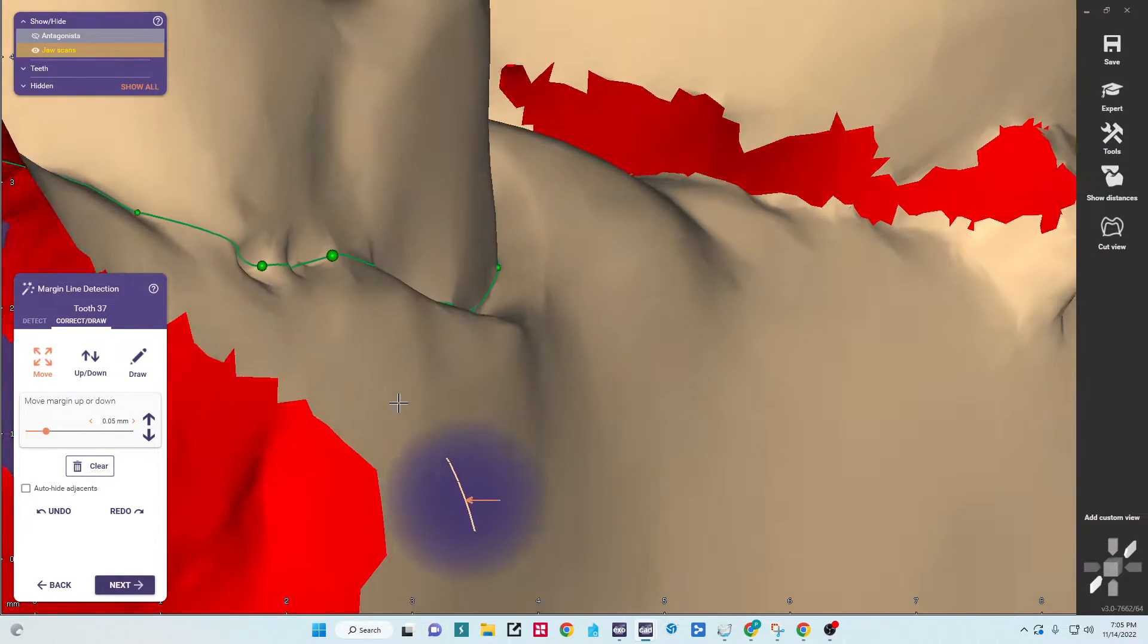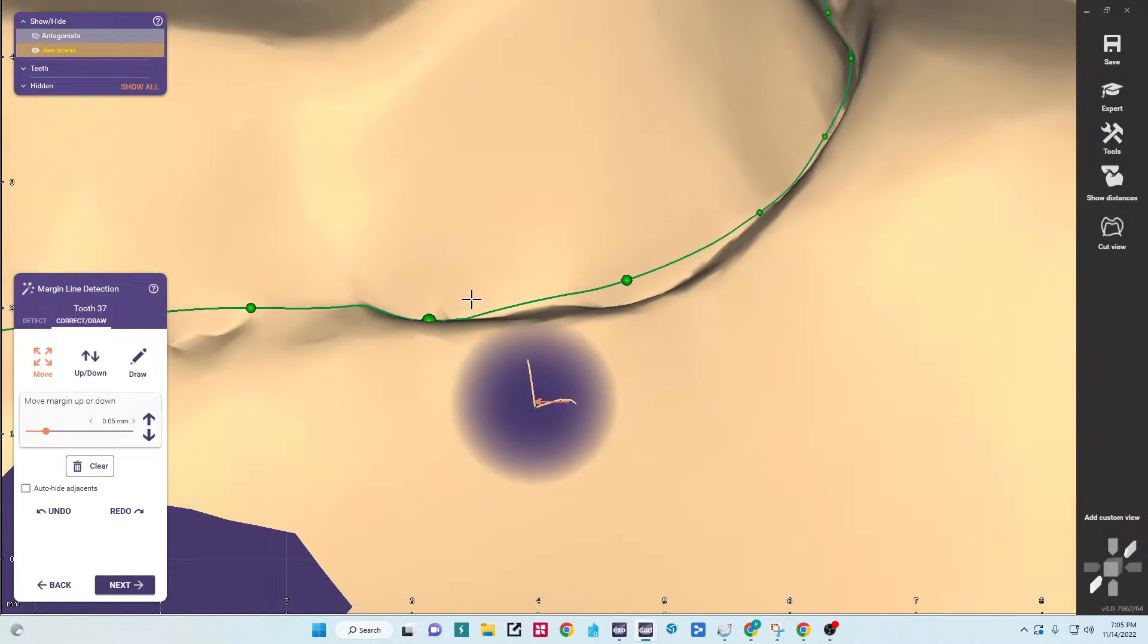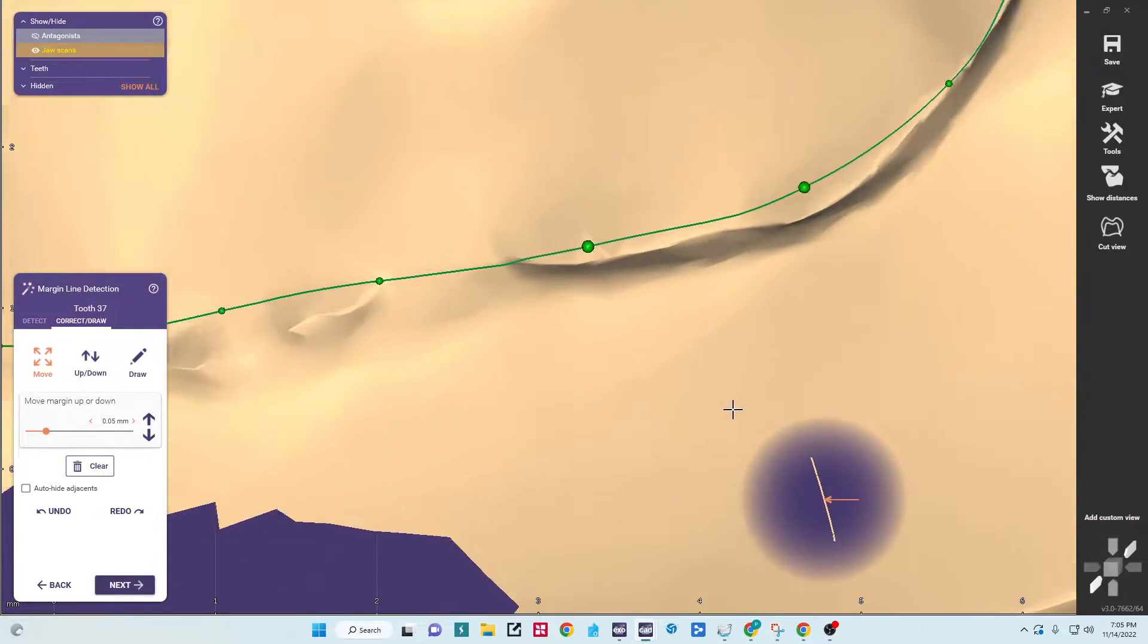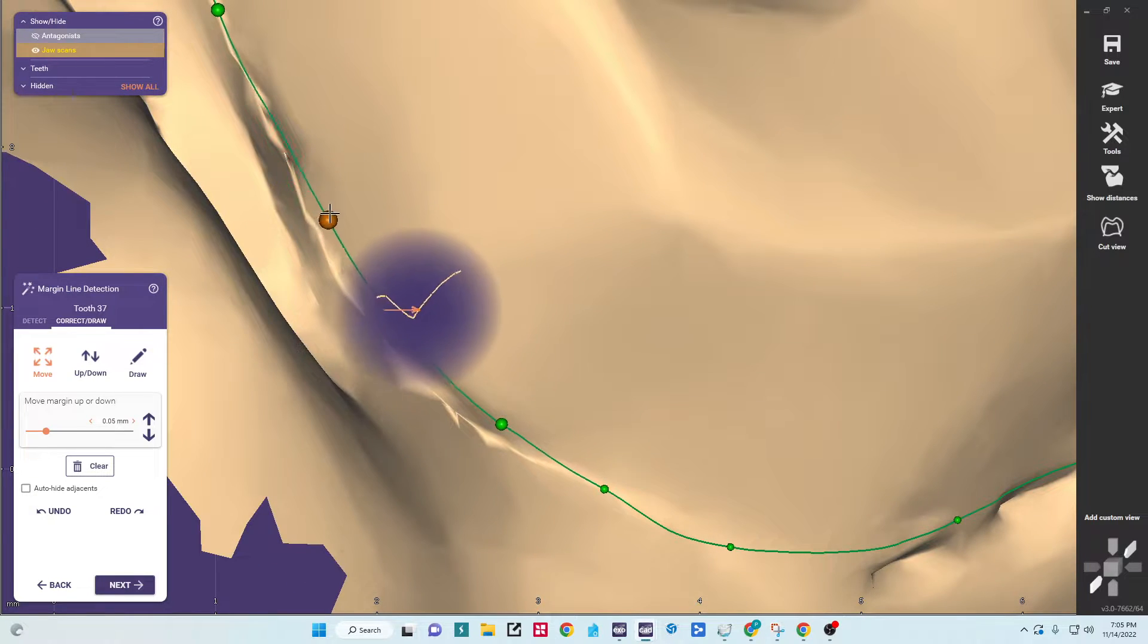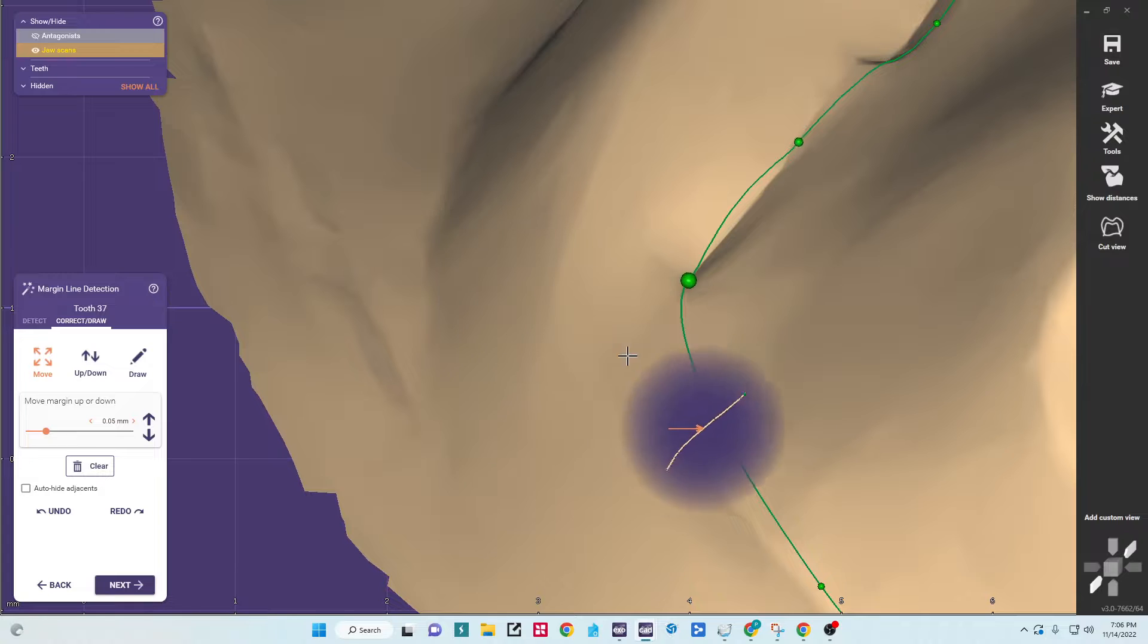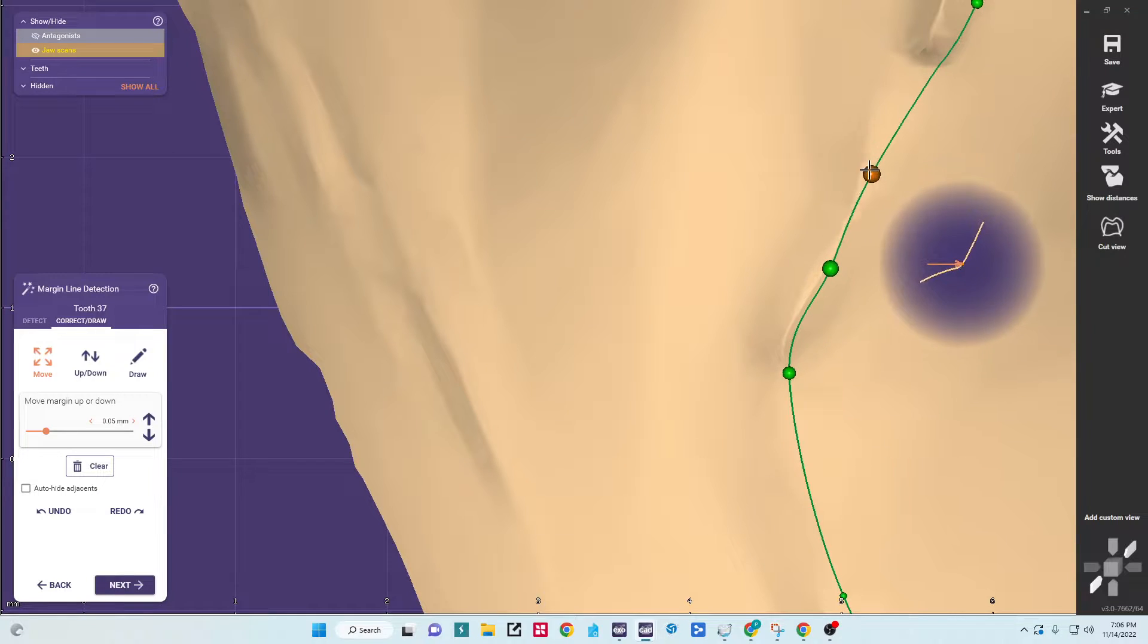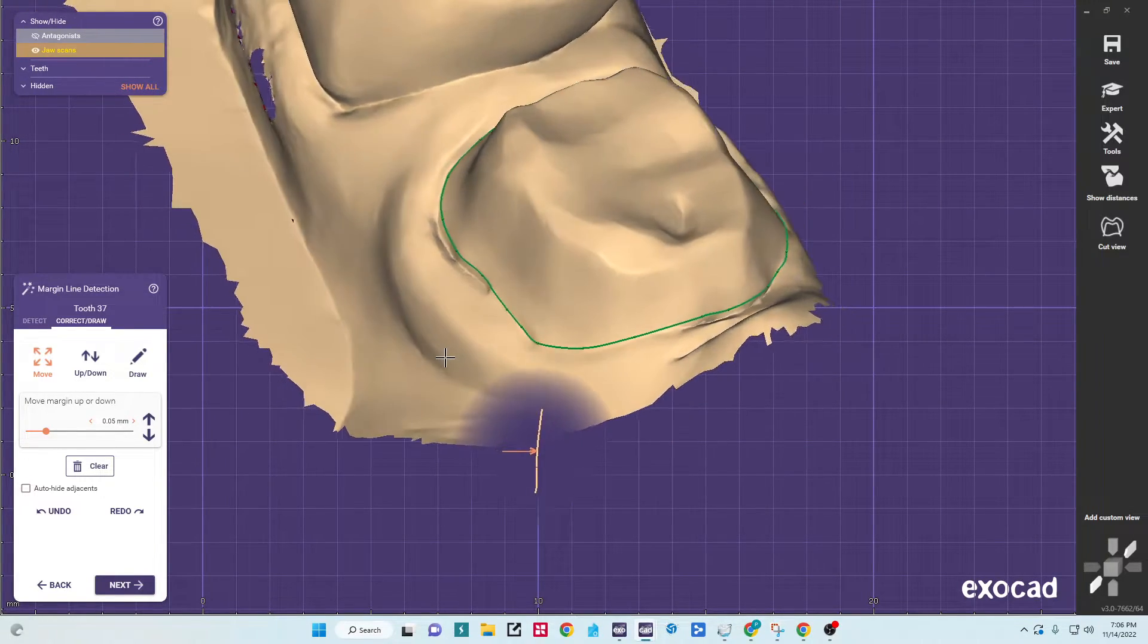This was a physical impression, so there's a little bit of flash in some areas. That's what I'm working around. So once I have my margin traced, I'll zoom back out and make sure that everything makes sense.